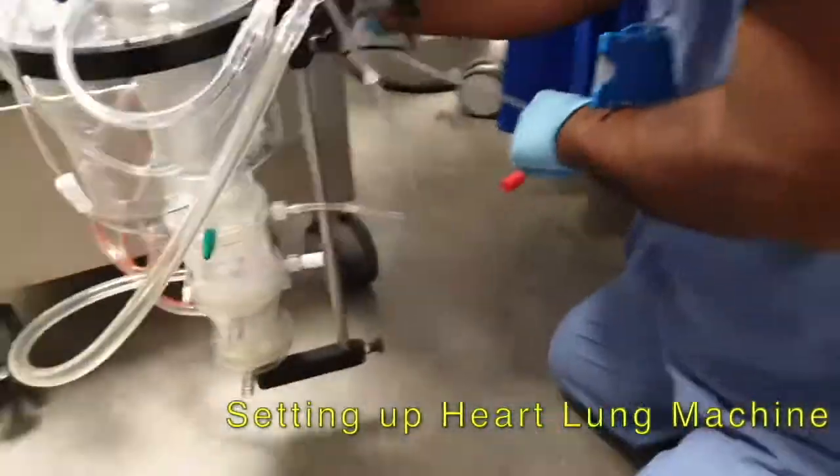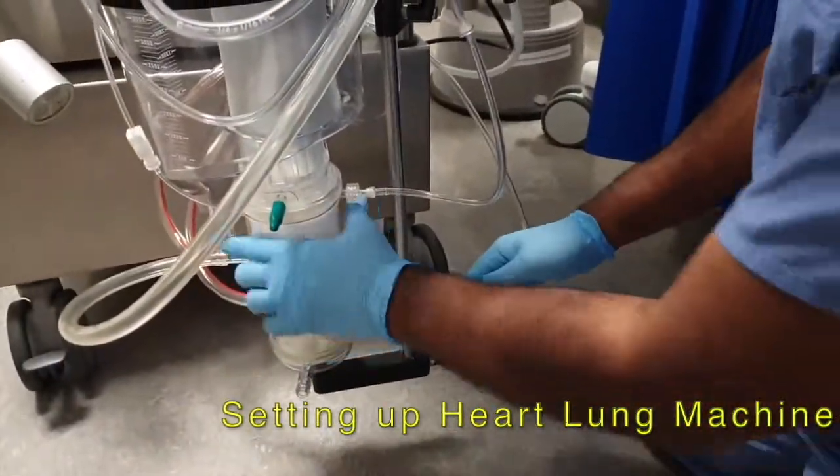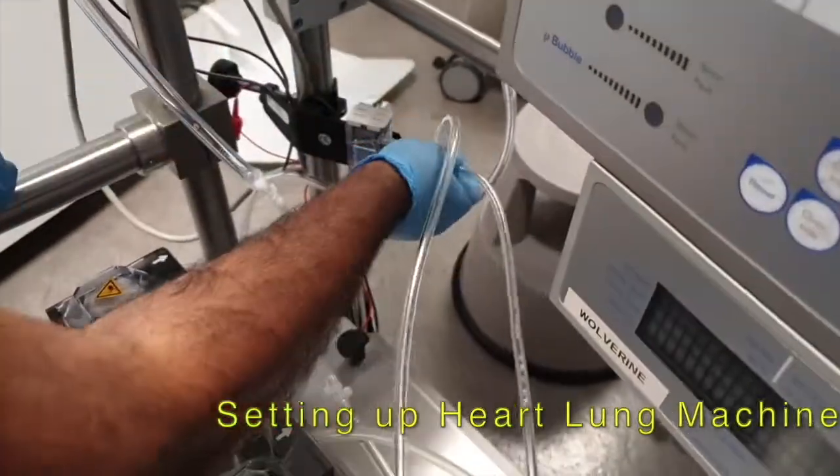We build a heart-lung machine which takes around 15 minutes, and we build this for every patient. We always have one standby in case of emergency.